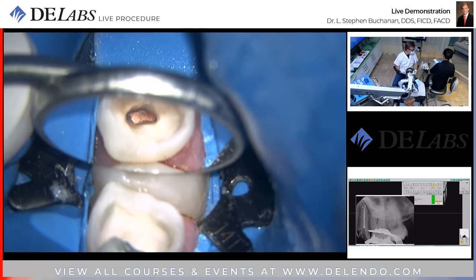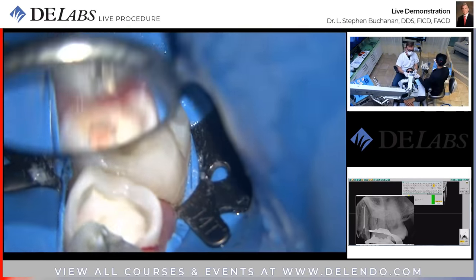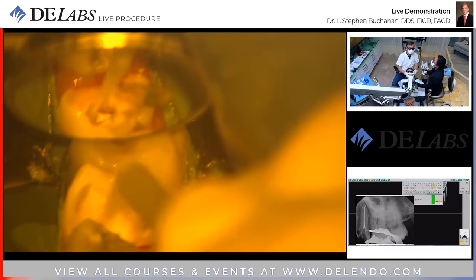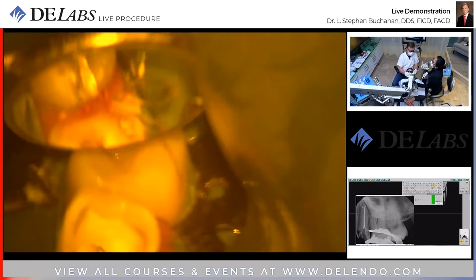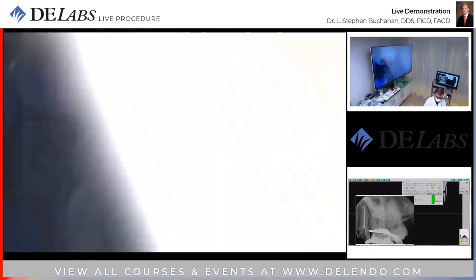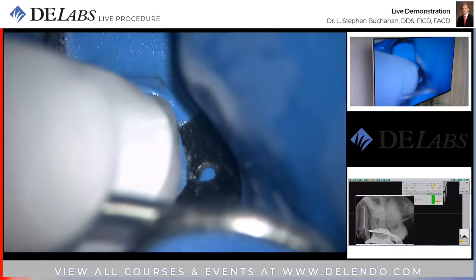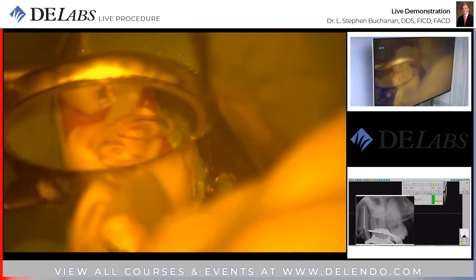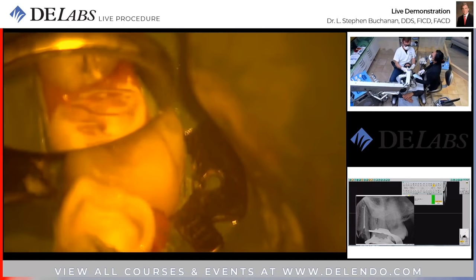This is Voco's glass ionomer. Oh, I'm sorry, we're putting a bonding agent in first. Got ahead of myself. Some more. Okay. Don't want to set up something until I can thin that out and get rid of it. It'll look like a huge void if I'm not careful.